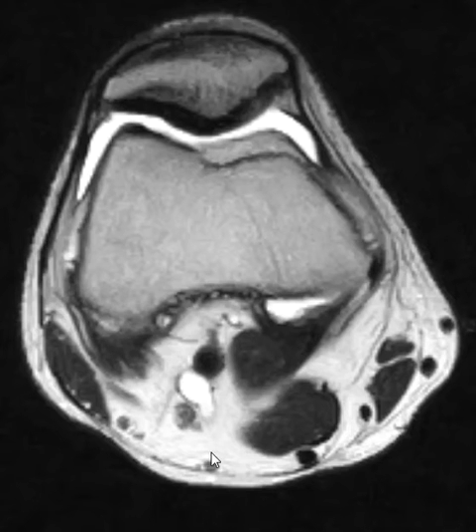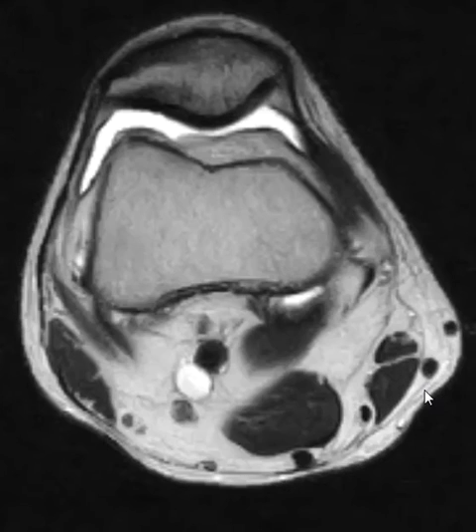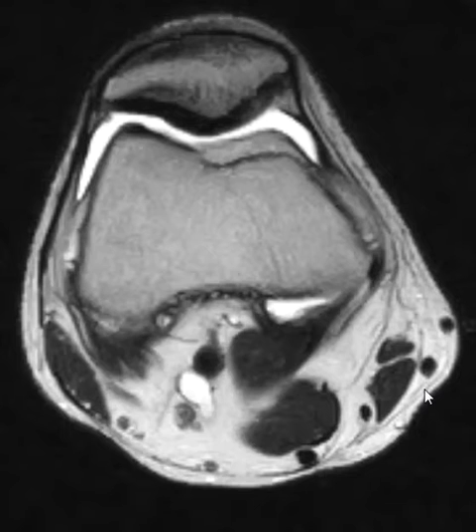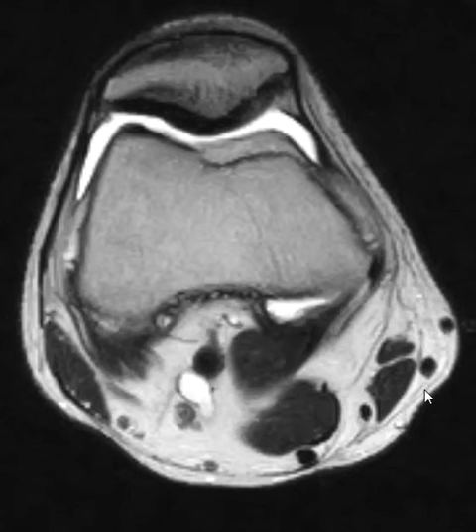Hello, this is Dr. Gay from First Lake MRI. This is a quick anatomic review of the PES-anserine tendon complex and also the semimembranosis, since it's so close to those. This is an axial T2 sequence above the knee joint.